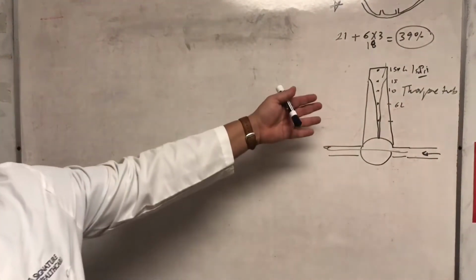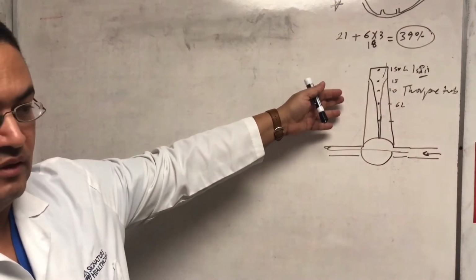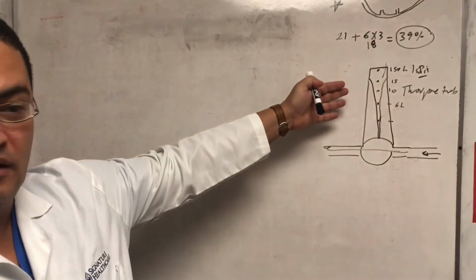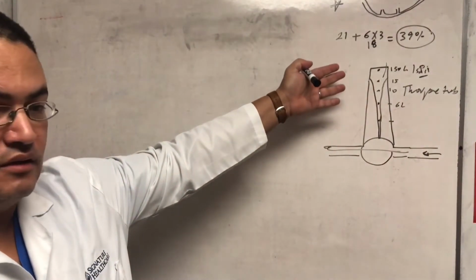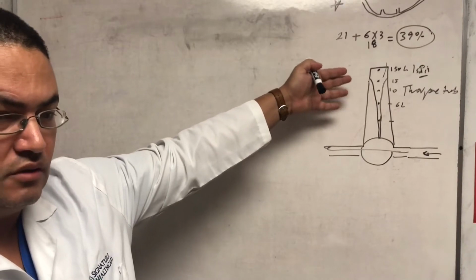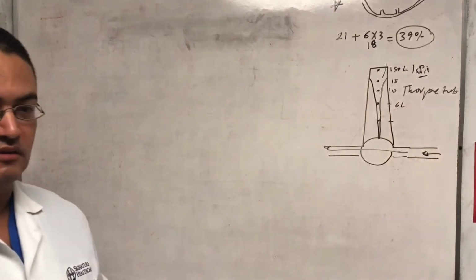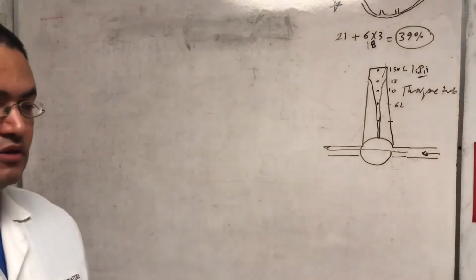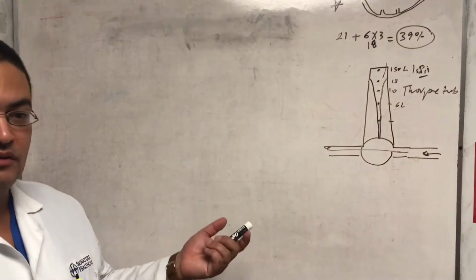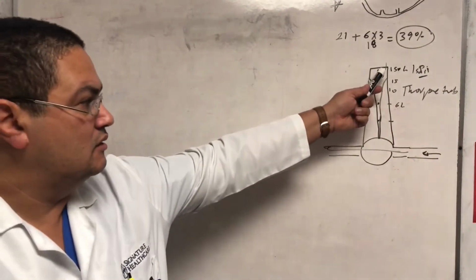Well, this company that made this, or companies that made this, some of them, or all of them, I think, need to be sued, because they didn't write anything. They didn't explain to anybody the common knowledge that 15 is the max. If you tell a nurse as you're coding somebody or resuscitating somebody, go to the max oxygen, you're gonna say 15. She's not gonna go 150, because nobody knows. That's the problem.